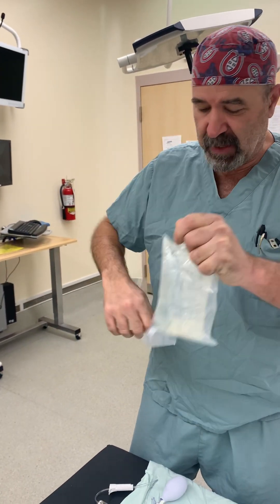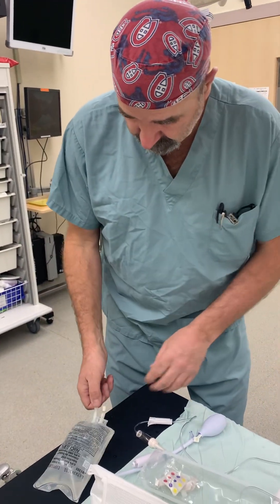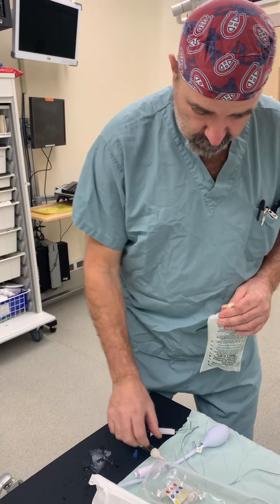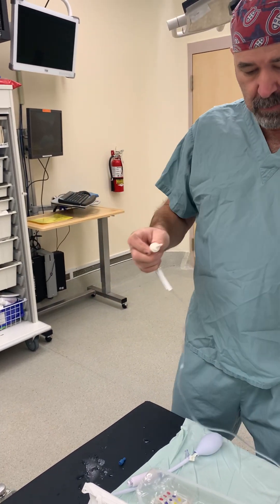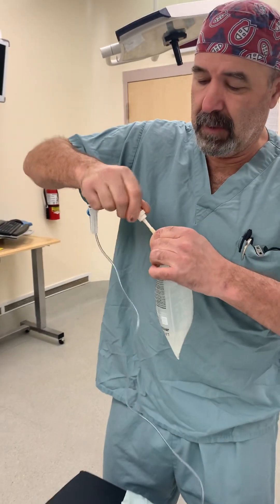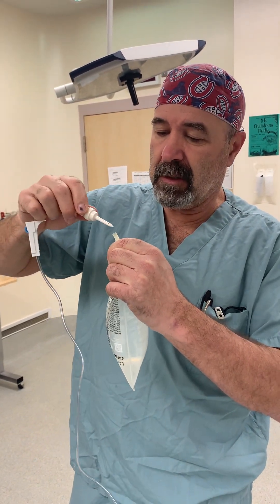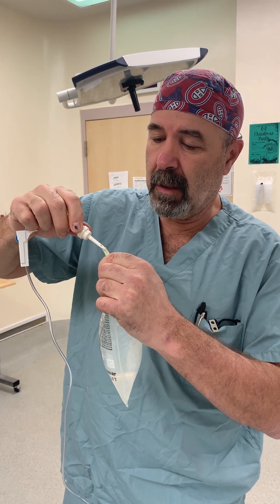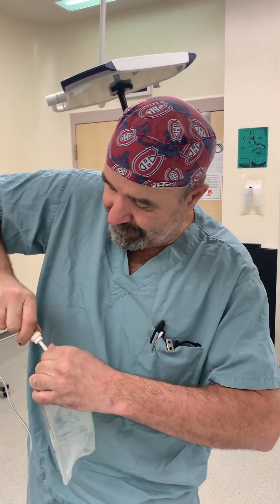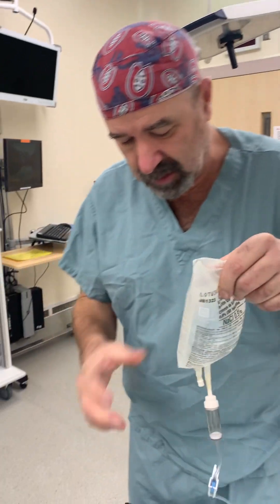We're going to open the bag. I was taught this by Narty many years ago — the first thing we're going to do is spike the bag. Take this out a little bit to get the air out of the bag, then spike it again all the way. Be careful because they often puncture through the insertion site here.